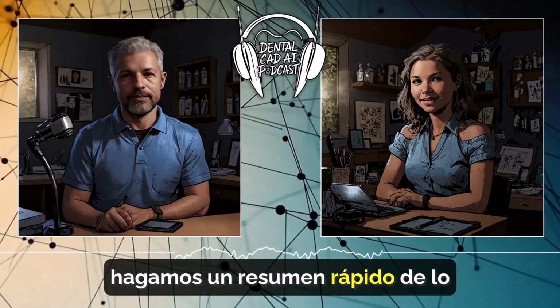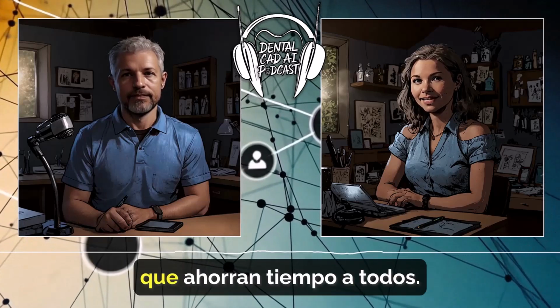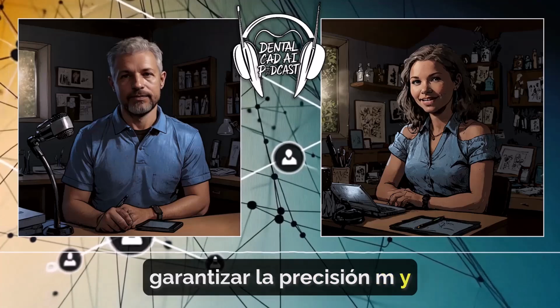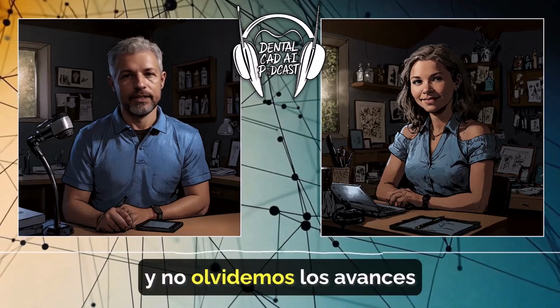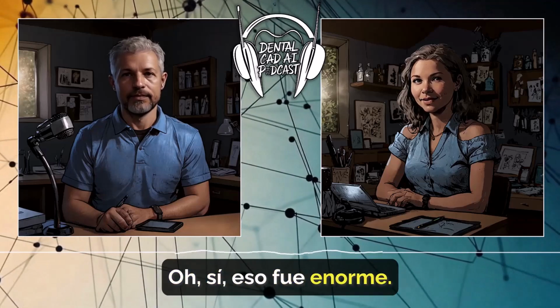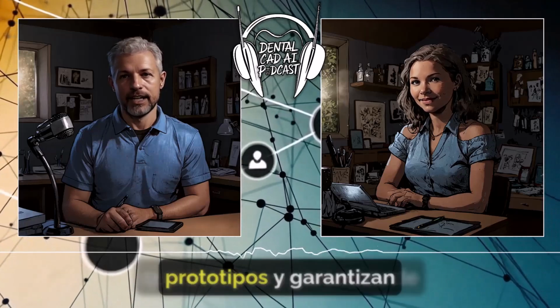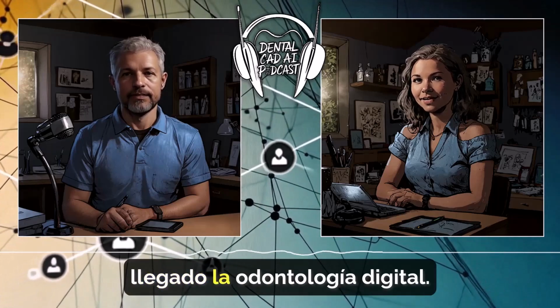Okay, so let's do a quick recap of what we've learned so far. We've got efficiency upgrades that save everyone time. Right. Tools that deal with imperfect scans to ensure accuracy, and improved collaboration and visualization tools. Yes, and let's not forget those groundbreaking advancements in denture creation. Oh yeah, that was huge, making the process so much faster and more automated. And all the enhancements to model creation, speeding up prototyping and ensuring accuracy. It's incredible how far digital dentistry has come.